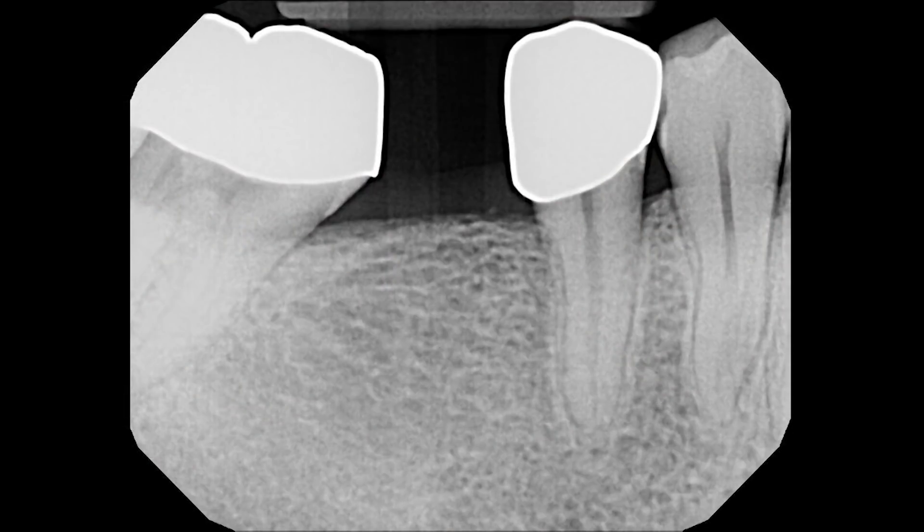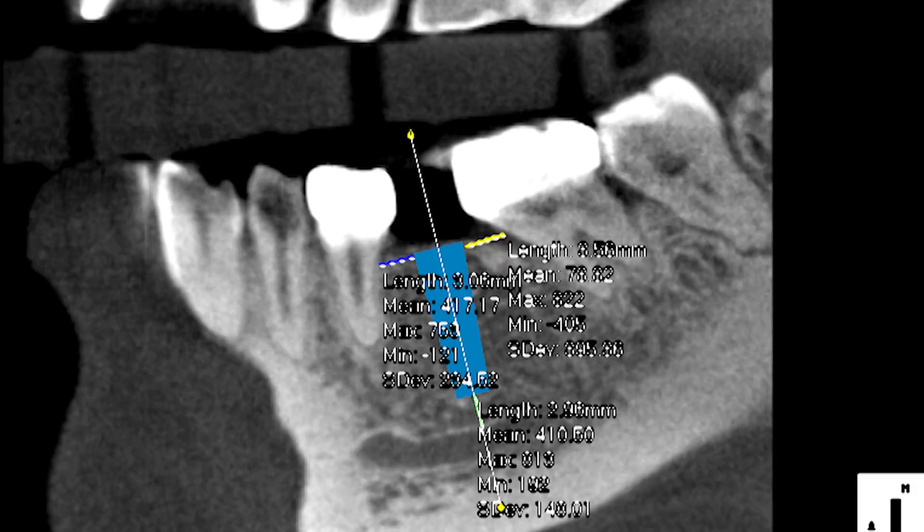Intraoral and radiographic examination allows us to determine the dimensions between the adjacent teeth and surrounding bone to select which size implant we're able to place safely and predictably. Following a general guideline of establishing at least 1.5 millimeters between the implant and adjacent teeth and 2 millimeters from the nerve, I select a Hahn 4.3 by 11.5 millimeter implant. A cone beam CT is an invaluable tool, giving us a three-dimensional digital visualization of the chosen implant within the edentulous space. After setting the planned position in the software, I have an estimated 3 millimeters or more between my implant and surrounding structures, safely within the recommended guidelines.